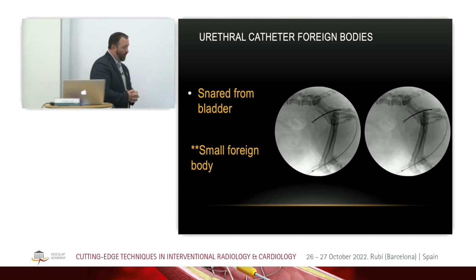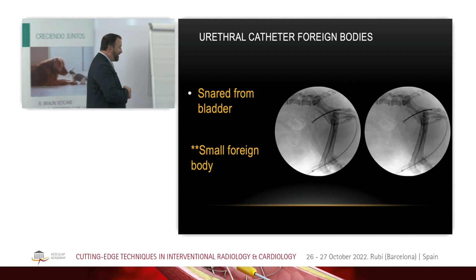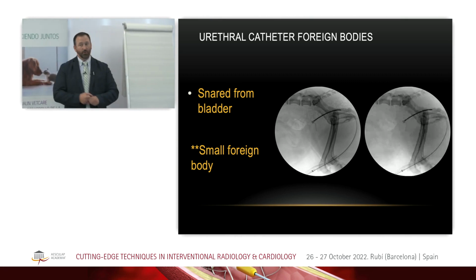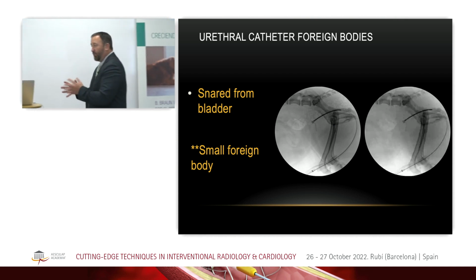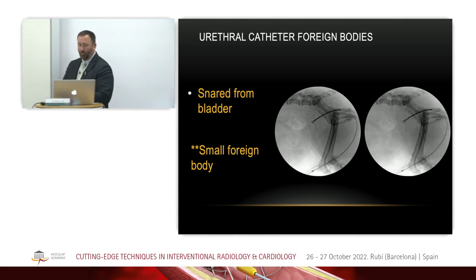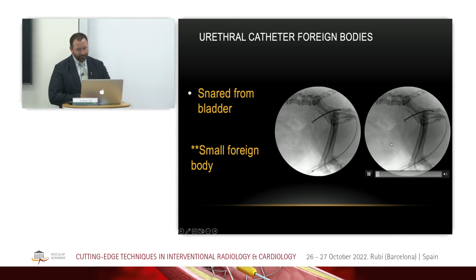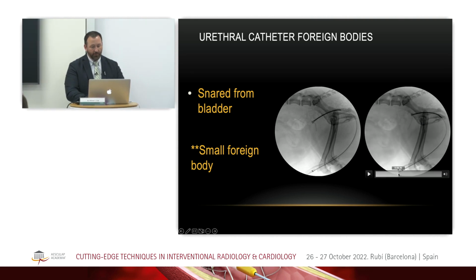It's kind of poor form to get it halfway into the urethra and then get it stuck in the urethra, because it's much more challenging to get out of the urethra. You just have much smaller amount of space, especially with a snare this big. You're not going to want to use a snare this big in the urethra. And so you want to try to prevent that coming in here further. And now we've got a good grasp on it, and we're going to just start pulling it out.